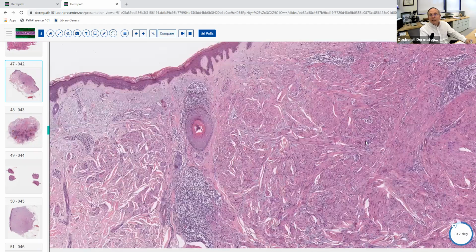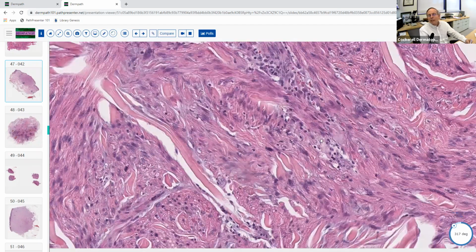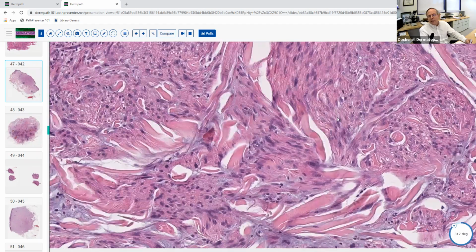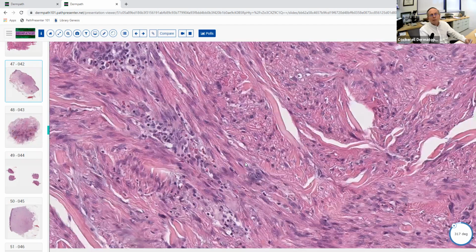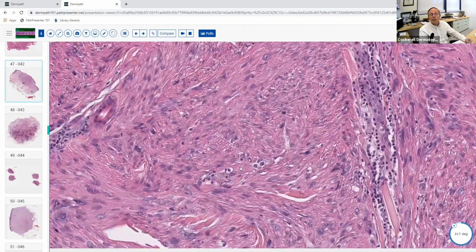And if you start looking carefully in this lesion, you're going to see there's some mitotic figures and some atypical cells. Now, these lesions, even though they get called leiomyosarcoma a lot of times, they're often really pretty low grade. So when a leiomyosarcoma develops in the skin, and this one really doesn't have a lot of atypicality, I might not have actually signed it out as a fully developed leiomyosarcoma. I might have called it an atypical leiomyoma.